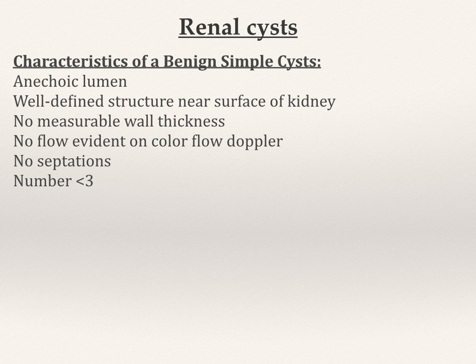And I tend to think of these as if you can make out that they have started kind of within the cortex and then they balloon out to whatever size, and then they hit all these criteria, I'm happy with them. I'll write it down as an incidental finding. About half of the people above 50 years old are going to have them, so it's just one of those things.